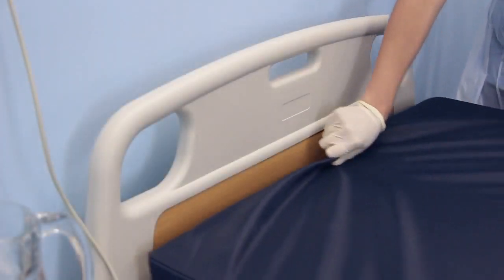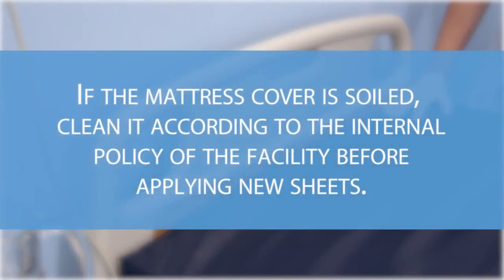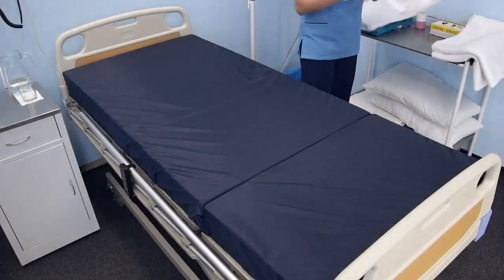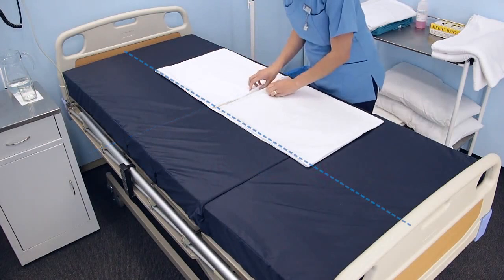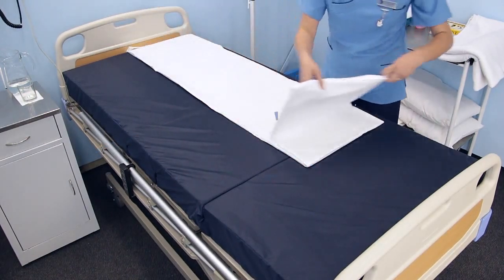If necessary, shift the mattress up to the head of the bed. If the mattress cover is soiled, clean it according to the internal policy of the facility before applying new sheets. Remove your gloves if any were used and discard them correctly. Using the clean linen, make the near side of the bed. Place the bottom sheet with its center fold in the center of the bed. Open the sheet in the length of the bed.